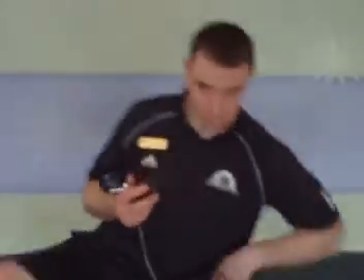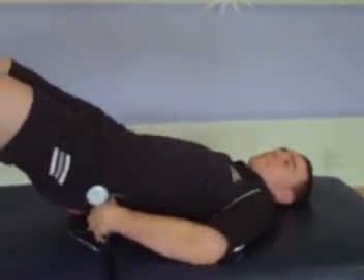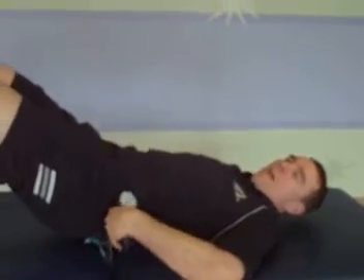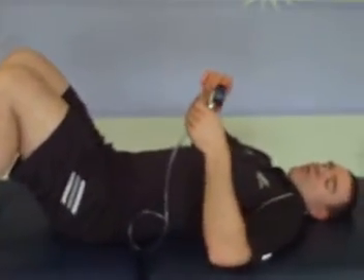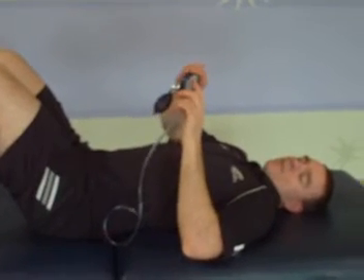So I'm going to jump ahead relatively quickly. I'm going to get this right underneath the low back. Once it's under the low back, we're going to have someone find their neutral position at their lumbar spine. Once they're in neutral, then we'll go ahead and inflate the cuff until it gets up to number 60.